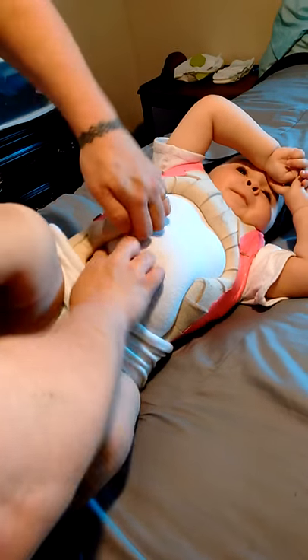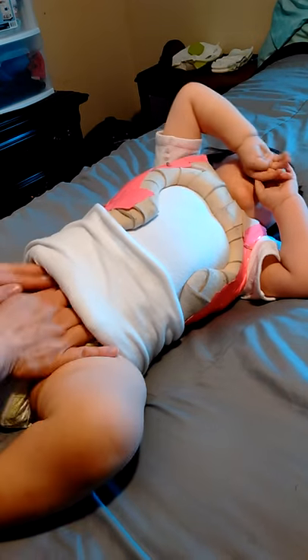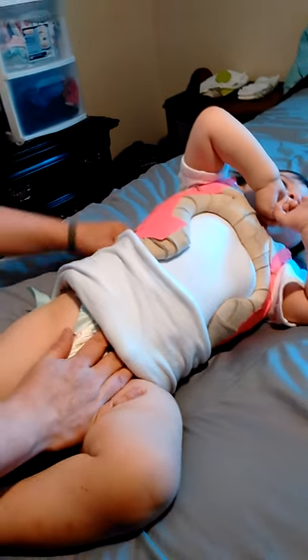Over wear and tear it's going to slide back up, go back underneath, and wrinkle and stuff. But as long as you get it down mostly even — I don't feel any wrinkles in the back area — nice and soft and clean again, for like five minutes.